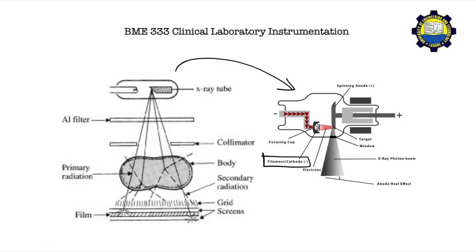The rate of production, more importantly, the rate of production of the electrons from this cathode that get directed towards the anode here is directly proportional to the current that is provided to this cathode. So the higher the current, the more electrons hit the anode. As a result, the X-ray beam is stronger, and then you get the result with the higher contrast, or the intensity of the beam is very high. So that's one way to understand the importance of the cathode filament.